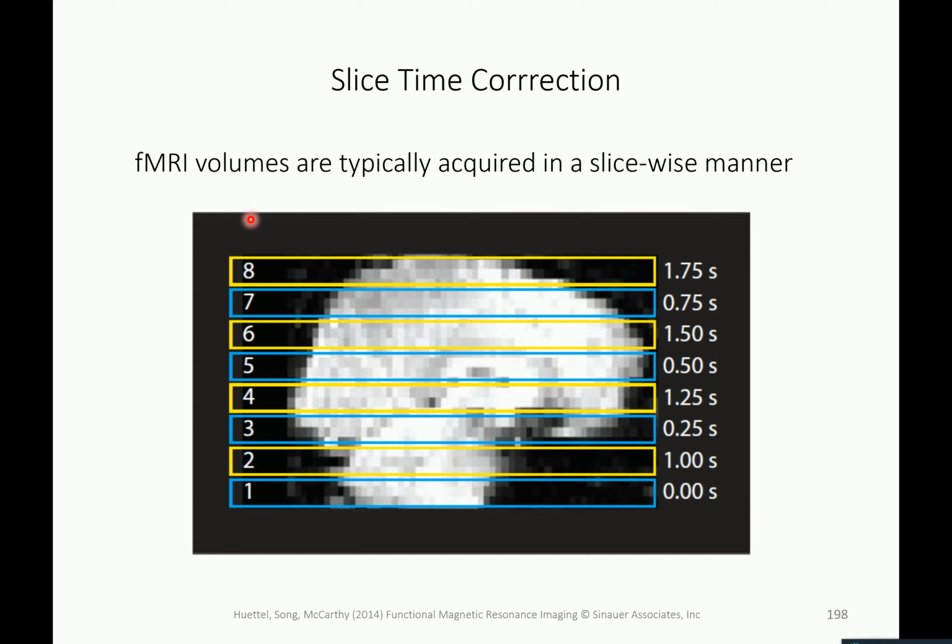I was thinking if it is also possible to... Yeah, it's also possible to do non-Fourier imaging, so the excitation-based signal encoding, for example along the y-axis or the z or the x-axis. That depends on how you actually do the gradient, so one doesn't have to do it according to the z-axis. But again, this is something we go into more detail once we actually do the imaging.